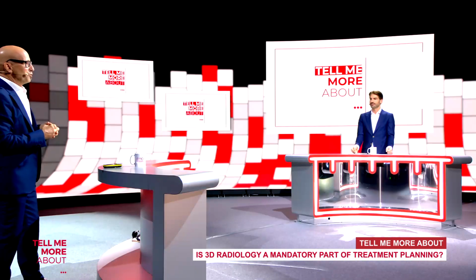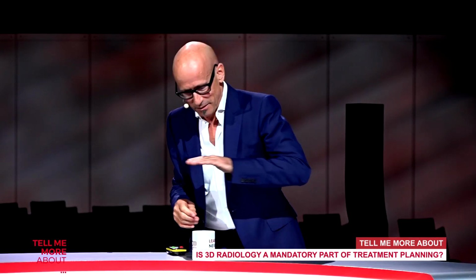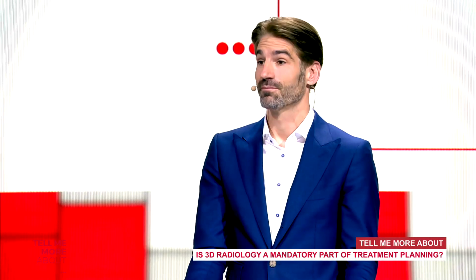Now we're talking about guidance. So you say a static guide. What are the tolerances you could expect on a static guide? Yeah, when you look at the software at the end, the company doesn't let you place the implant at 0 distance to the bone. This is too risky, because they know all the failures in the whole technology are between 1 to 2 millimeters. And that's significant. And that's a lot.